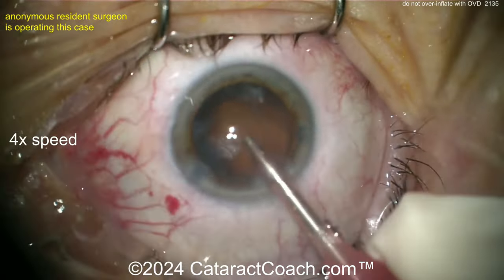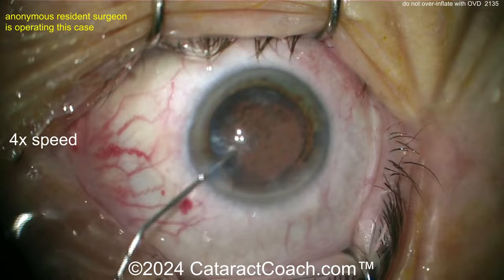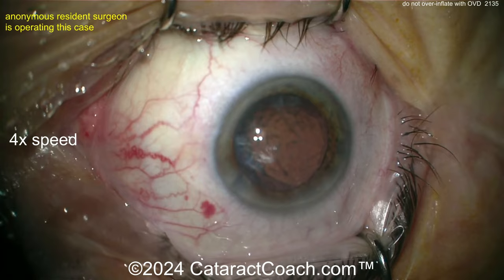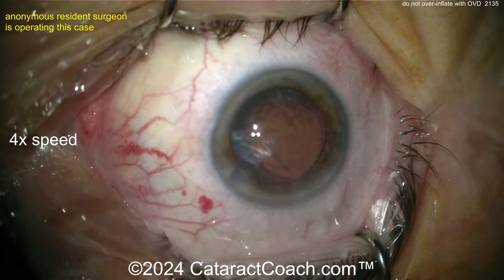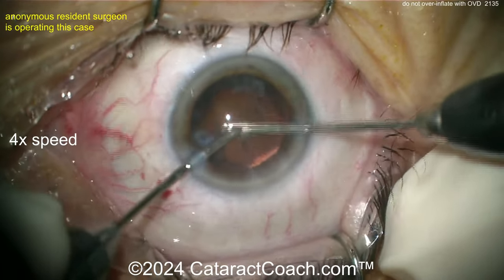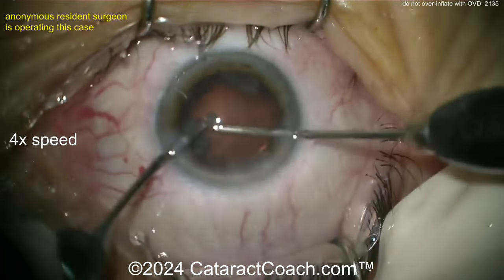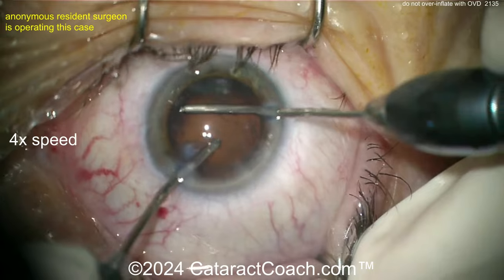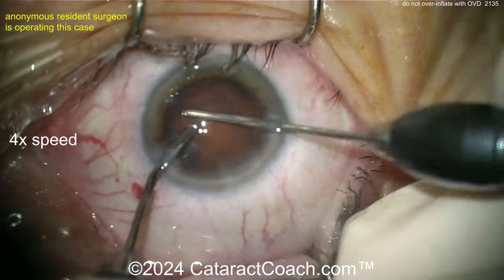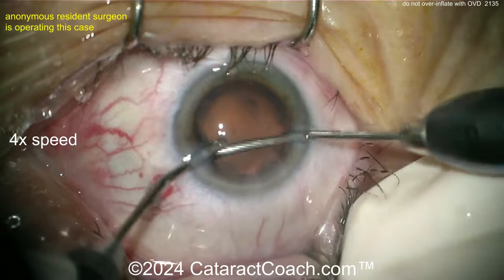Take out the last couple pieces. Switch over to the IA probe. I like the idea of putting a little viscoelastic in now to keep that bag supported and inflated, but don't overly inflate it. Remember, viscoelastic is a strong substance — OVD can certainly push tissues around and can push that rhexis right out radially towards the zone of support. Bimanual IA, you're going to have a lot more control and get 360-degree access to the capsule bag equator to get the cortex out. I would do that radialized area last.